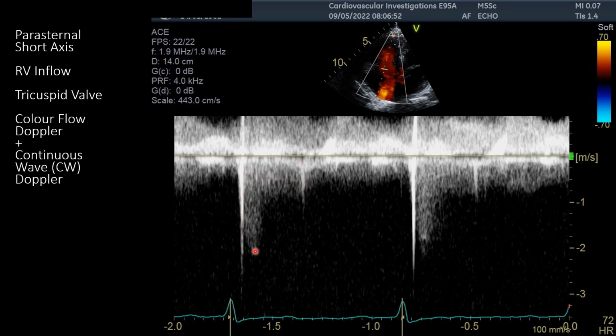We can see an incomplete tricuspid regurgitant spectral trace below the screen, below the baseline, apologies, and occurring during ventricular systole. So that gives us the information that there's this regurgitant tricuspid jet, but if it was complete, it would be filling out a complete dome shape, and it's not doing that. So that's suggesting that this is a trivial to mild tricuspid regurgitation based on spectral Doppler assessment.